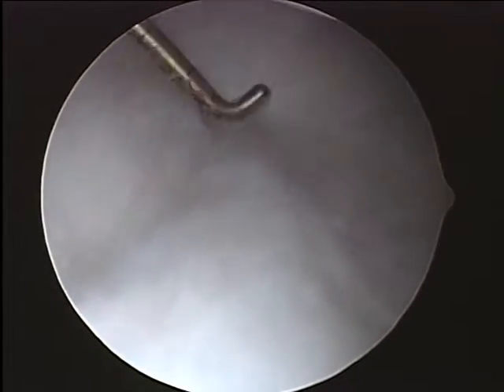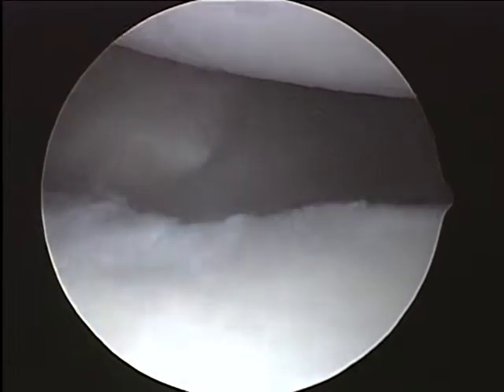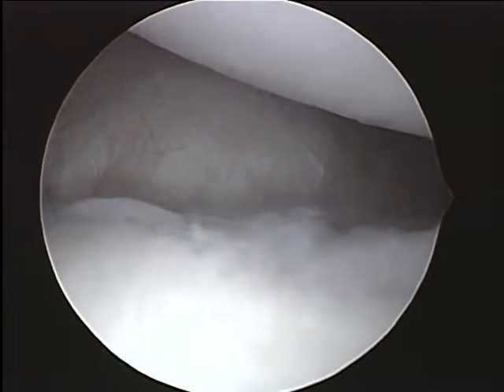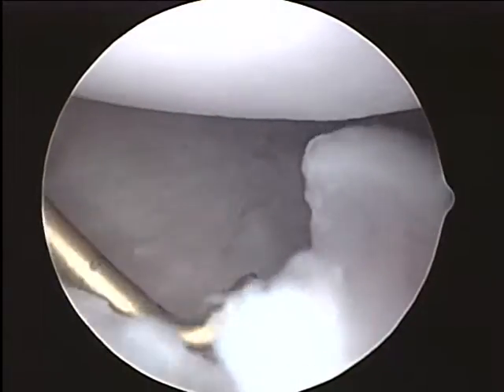It's on the other side of this where that transferred coracoid process is. But actually, all this looks pretty encouraging. This is a good-looking joint, and I think it may be mostly that that dang screw is what's giving you the biggest issues.